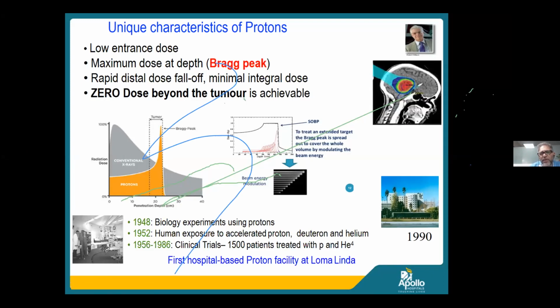And then PSI in Zurich, and Japanese centers and many other centers, and Mass General in the United States as well. They started building up these cyclotrons and synchrocyclotrons to have protons and other heavy charged particles as well. But as was also mentioned, although this gives this classic Bragg peak, unfortunately the tumors are not pinpoint peaks like that. They have a definite finite size.